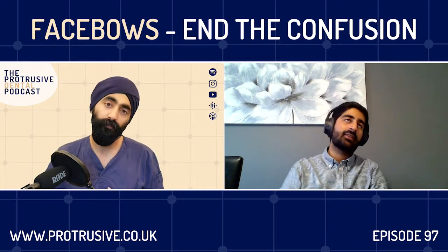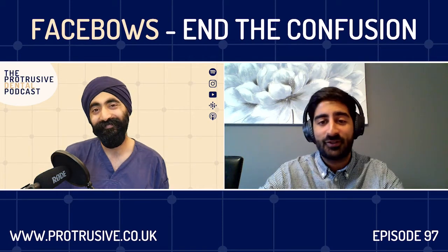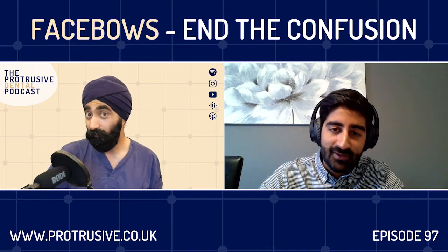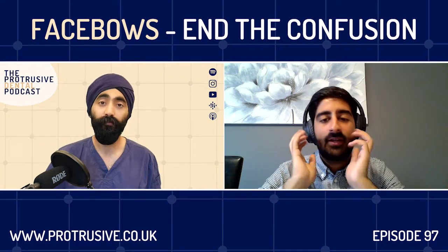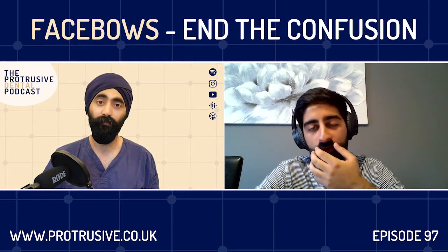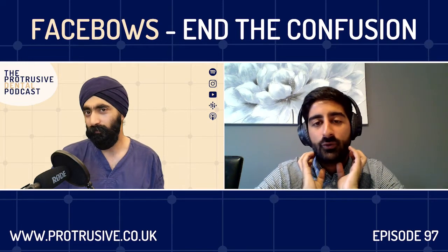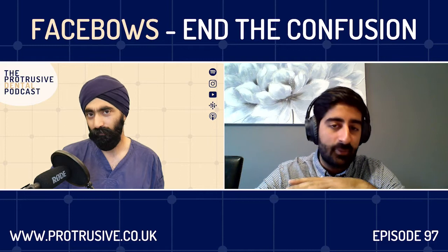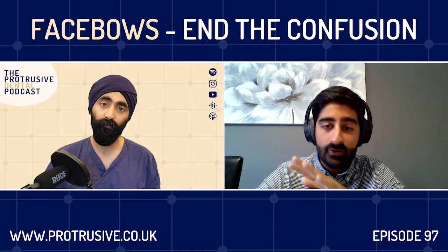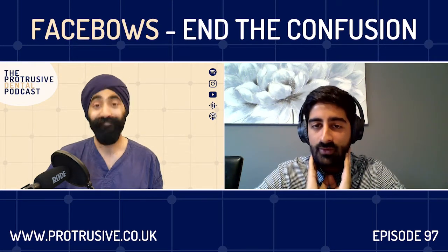Yeah. And then the second one is my judgment call. We're always going for mutually protected occlusion these days, which means we've got posterior stable ICP contacts and we're going for stable anterior guidance. So we see the upper 3 to 3 give good lateral canine guidance. That means generally if you're really working on 4, 5, 6, and 7 and the patient has stable canine guidance, then usually you can get away without using a Facebow. If you're just restoring single or 2 units, 4, 5, and 6, you'll get away with it.